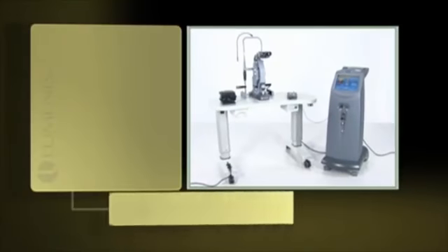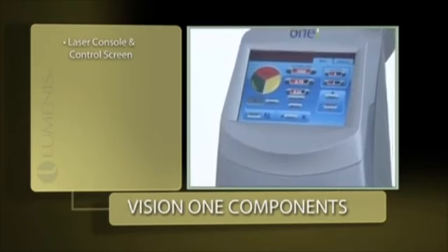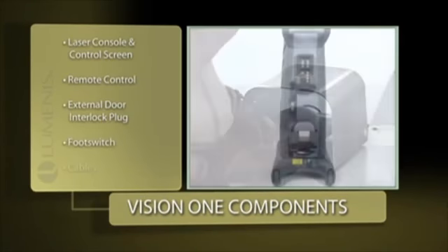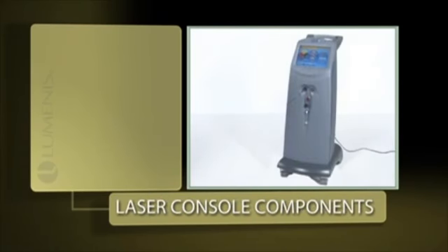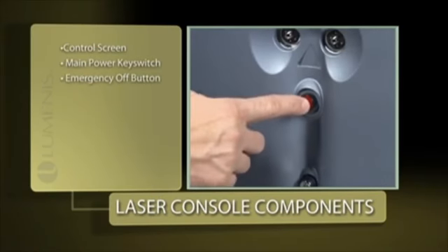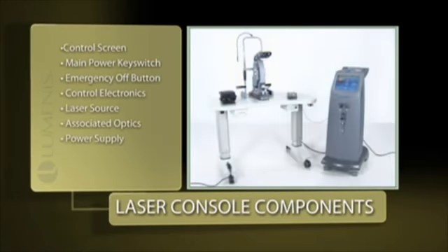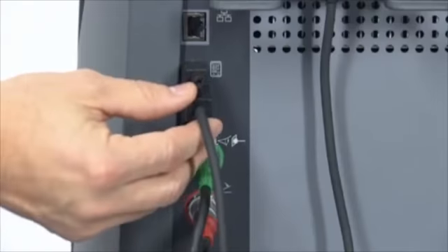Here are the components of the Vision 1 laser system. A laser console with control screen, a remote control, an external door interlock plug, a foot switch, and all electrical cables necessary for proper connection. The laser console houses the control screen, main power key switch, emergency off button, control electronics, laser source, and associated optics and power supply. The laser console is the central unit to which the laser components and delivery devices are attached.